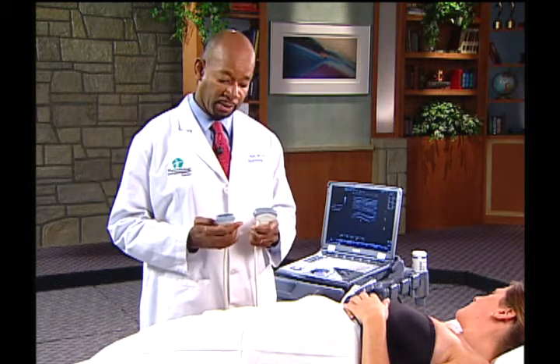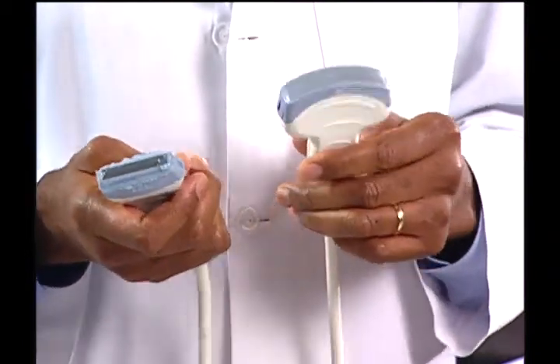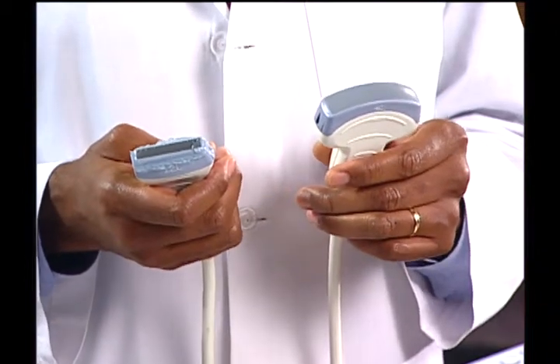And again, I demonstrated how you actually can change the frequency and showed how that changed the depth of the images that you attain. So one of the nice things about the Logiq system is having the flexibility of being able to use various transducers to suit your patient profile.